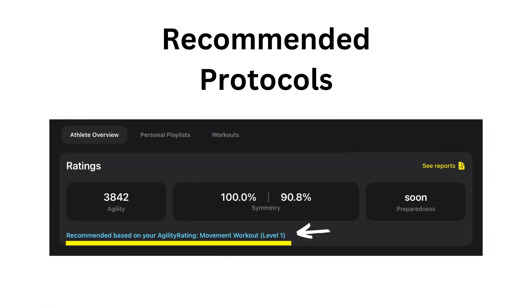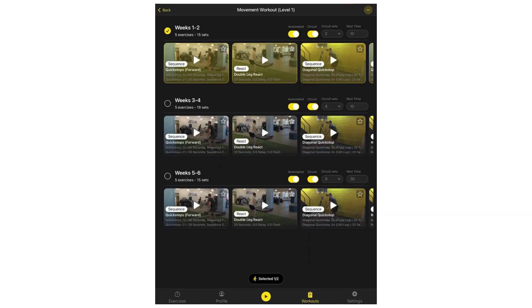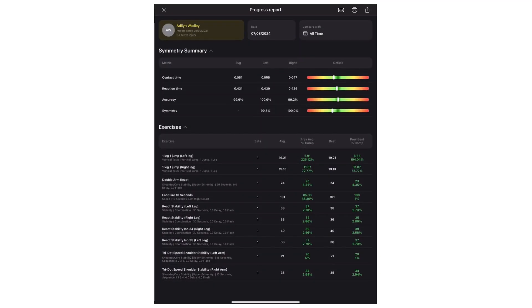Immediately following the assessment, QuickBoard provides patients with a recommended protocol based on where they need to improve, allowing the therapist to track rehab progress and provide objective data.